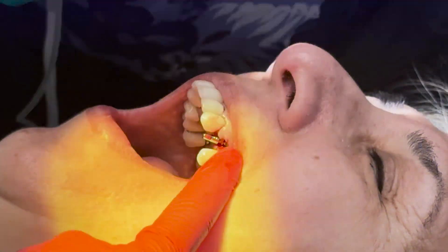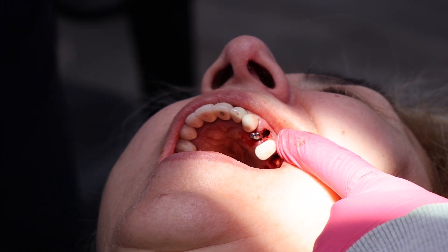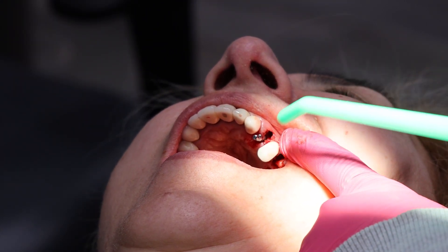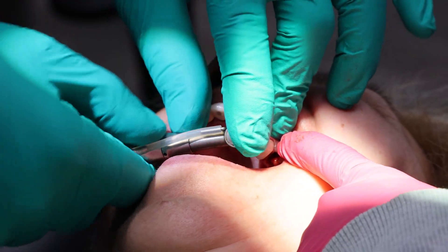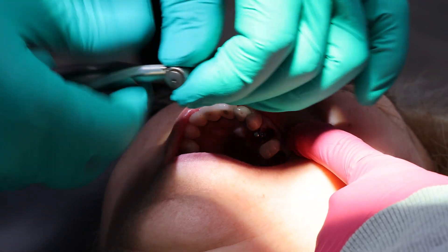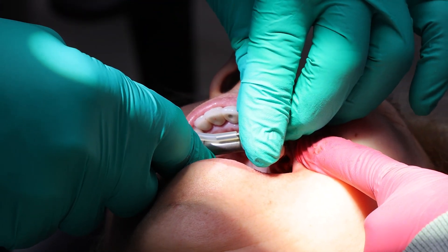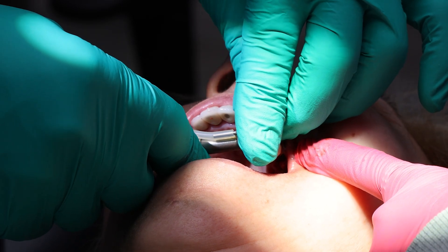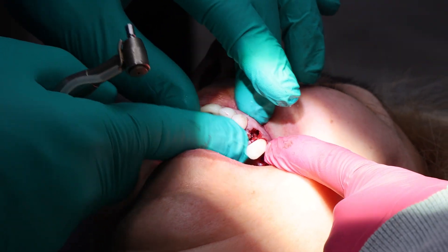We have the mono implant. Now I'm going to put it in with the driver on the contra-angle driver. You hear the beeping sound — that's good. That means we've reached 30 newton-centimeters of torque.